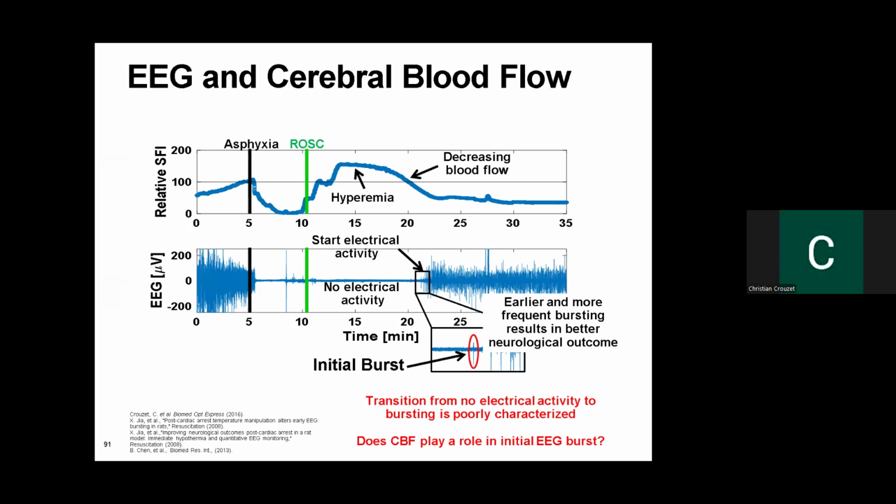So the question is, what's the maximum field of view? The biggest field of view that I've probably worked on is about 20 by 20 centimeters. And then the smallest is what?